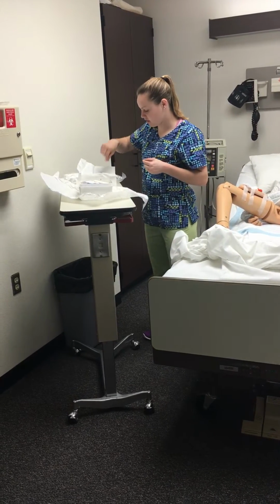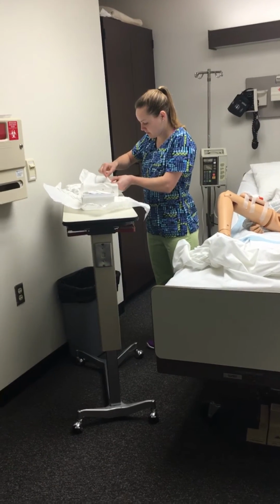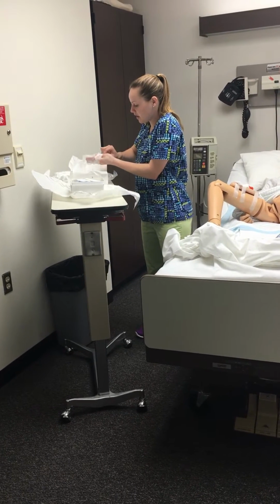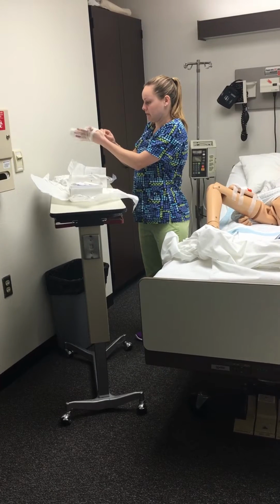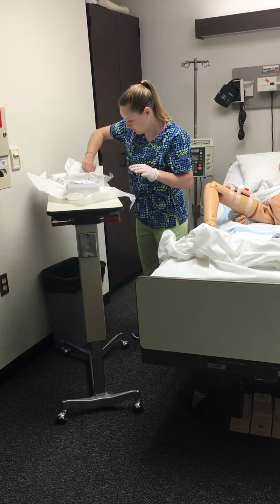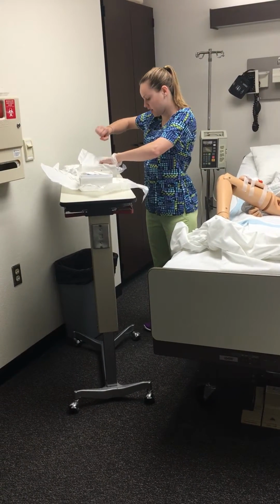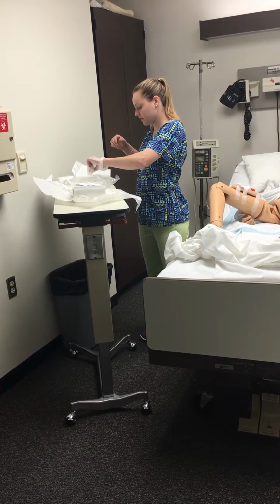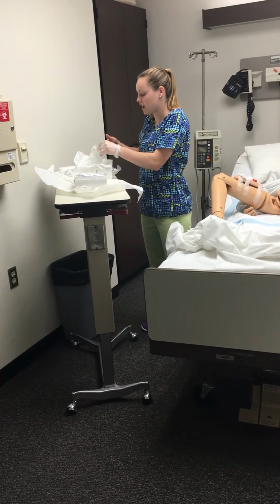I'm going to put my gloves on, touching only the inner part right now. Okay. No, don't grab it with that hand. Oh, and we'll grab it with my other hand. Sorry, I touched this with my hand, and that would violate sterile technique. I would touch it with my gloved hand.